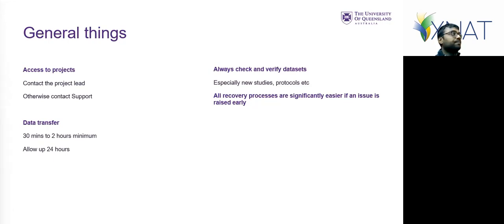So I would say for her that we're only going to keep it on the scanner for 2 weeks. We don't have the space to store it longer than that. So we'll assume, if you haven't told us that it's up in the cloud, because we can't see it now, that it's in XNAT. So you really do need to check your data within those 2 weeks and tell us that you don't have something.